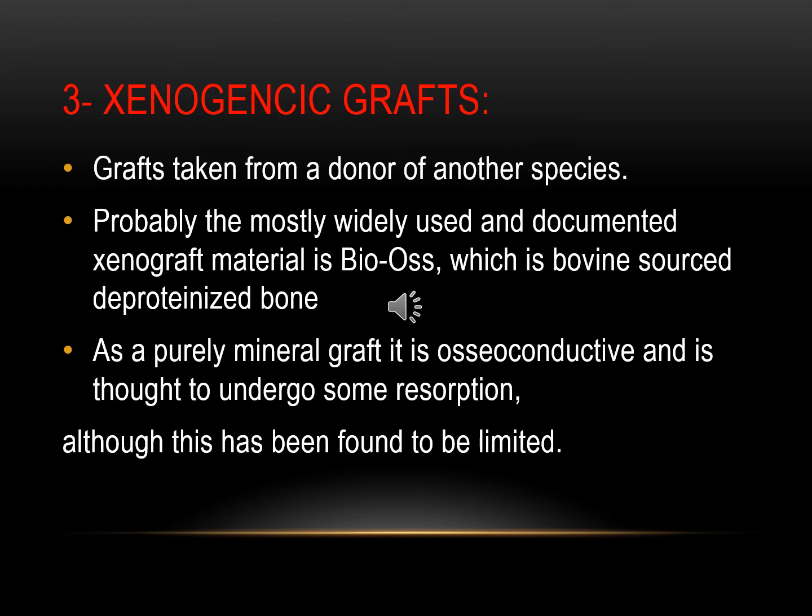Xenogenic grafts are grafts taken from a donor of another species. Usually we talk about graft taken from an animal to treat the bony defect of our patients. The most important and the most famous brand of bone graft is BioOss. BioOss is a bovine-sourced deproteinized bone graft.